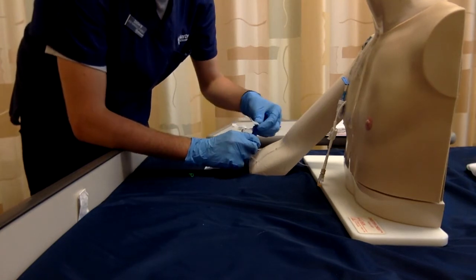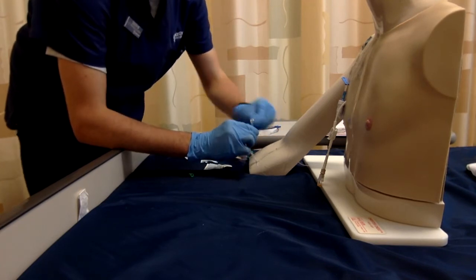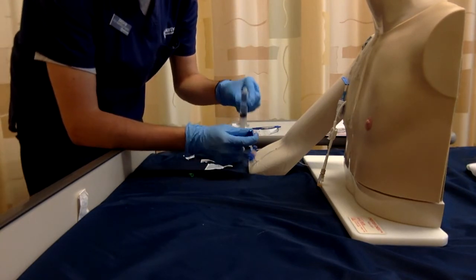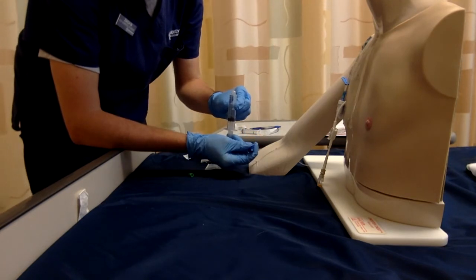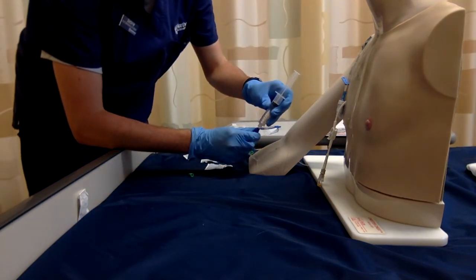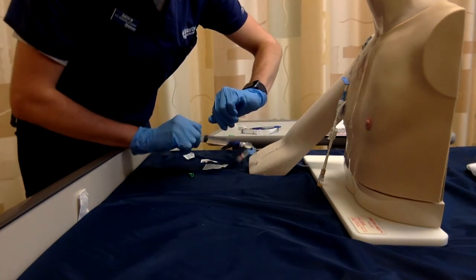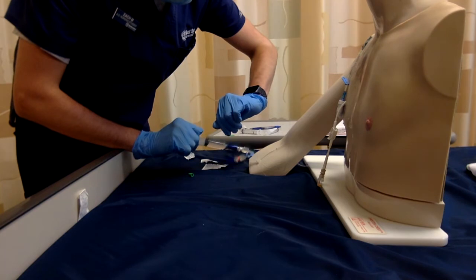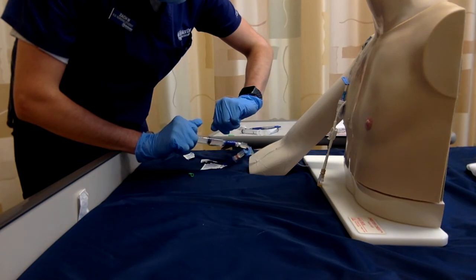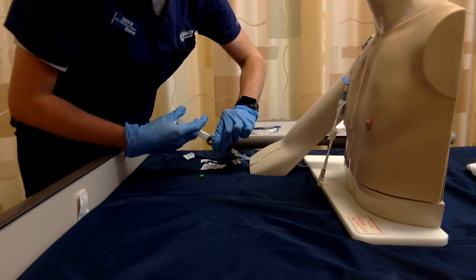Once again, cleaning the site. And so, with the post flush, for the first 5 mils, we are going to flush it at the same rate as the medication, so over 2 to 5 minutes. So once again, I'm just going to speed it up, but I would flush it for 2 to 5 minutes for the first 5 mils. Okay, once it hits the 5 mils, I can flush it regularly. Once again, pulsating, because it's the PICC line.